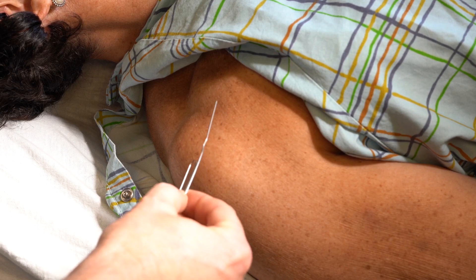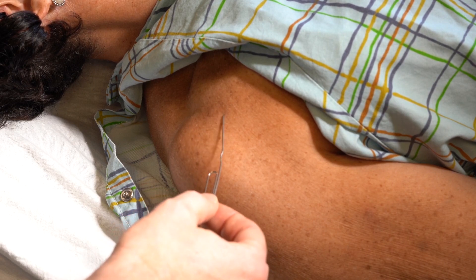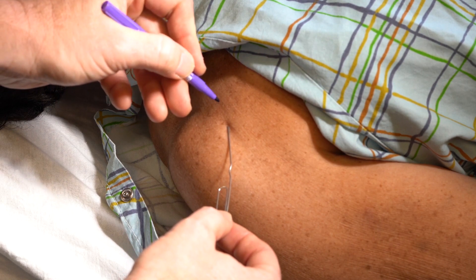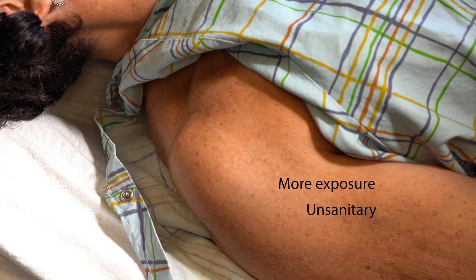Many physicians use whatever metal object is available to see under fluoro and mark using a skin marker. This can take more time, lead to more exposure, and can be unsanitary.